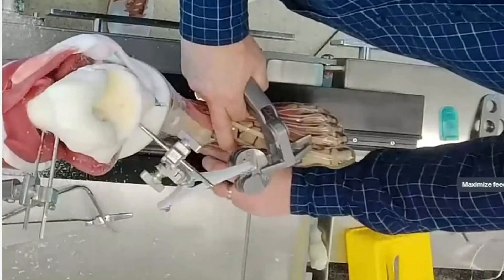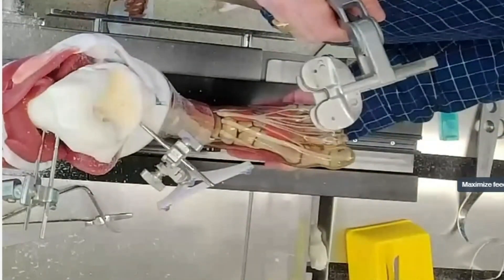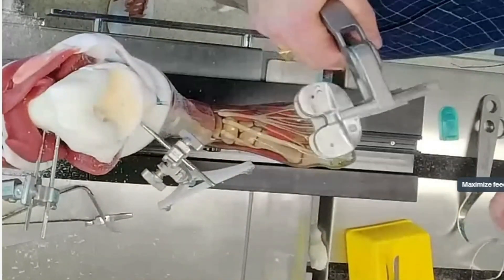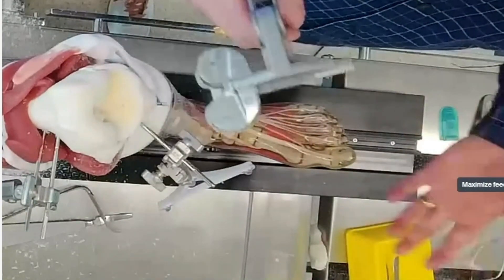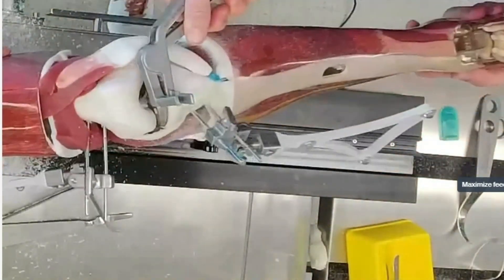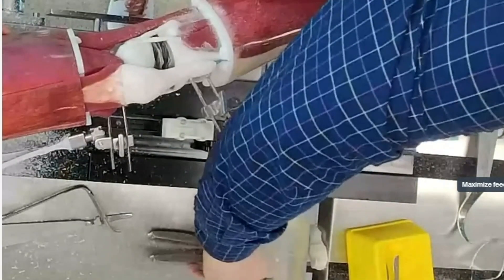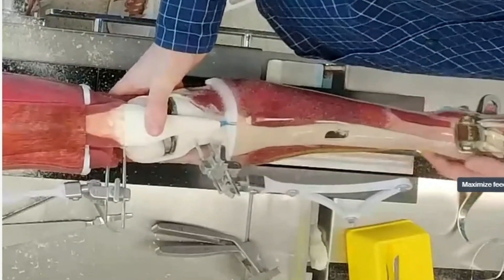This has always been one of the challenging parts using other sawbones or other models, where the ligaments are either fixed rope with no elasticity or rubber bands effectively with no real endpoint. You end up getting graphs that basically don't look realistic and don't make sense from a knee perspective. Whereas with this model and these soft tissues, I can also re-evert the patella.